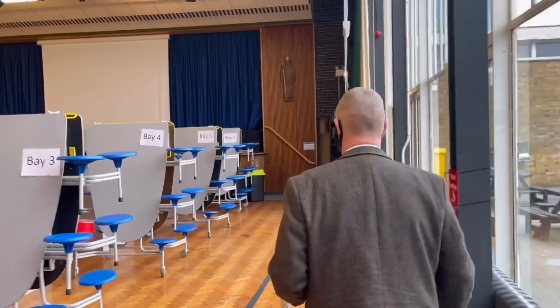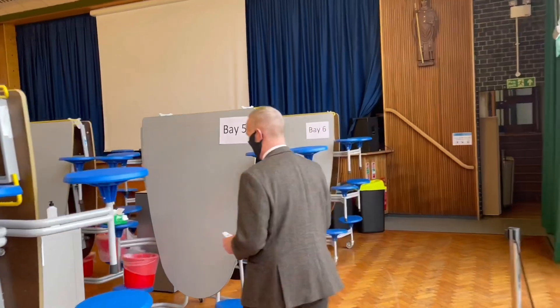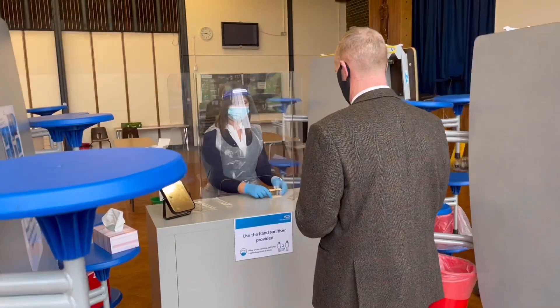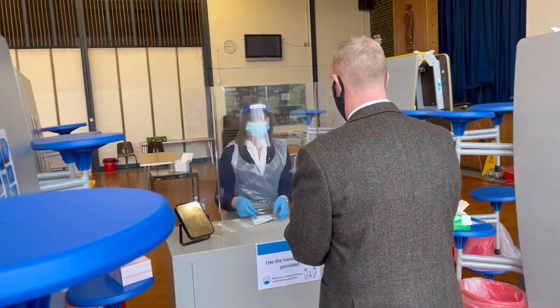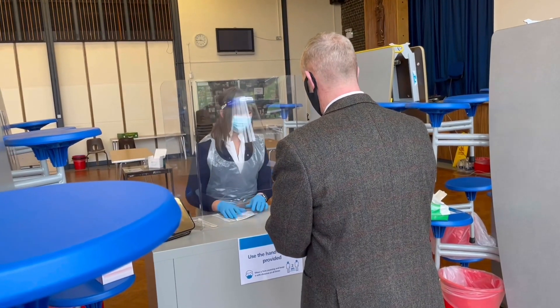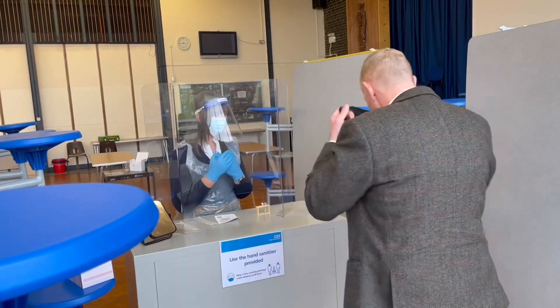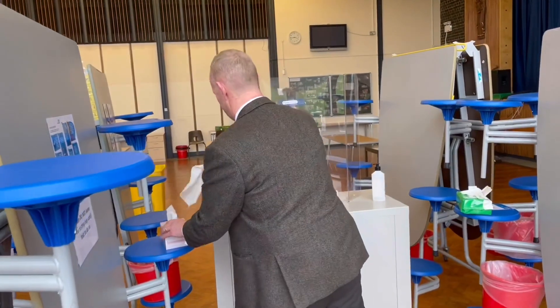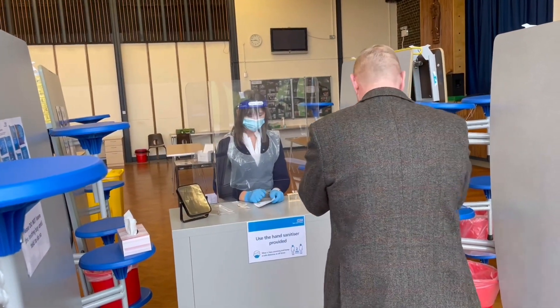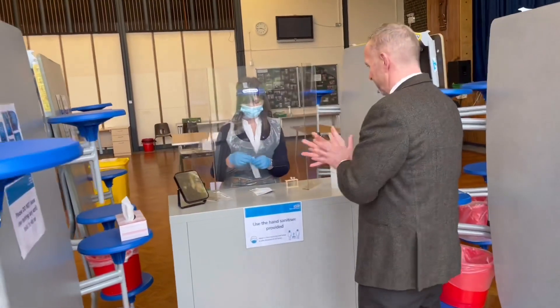In this case you are heading to bay five, clearly labelled at the top. When you arrive at the bay, the first thing you do is hand over your card and you'll be directed by the test staff. You'll be asked to remove your mask, blow your nose, dispose of the tissue in the red bin provided, and then hand sanitise.